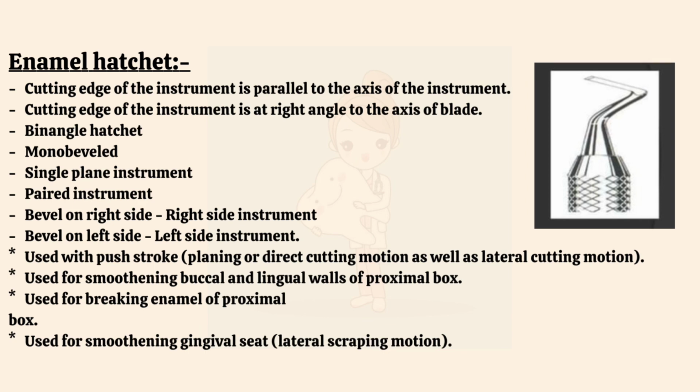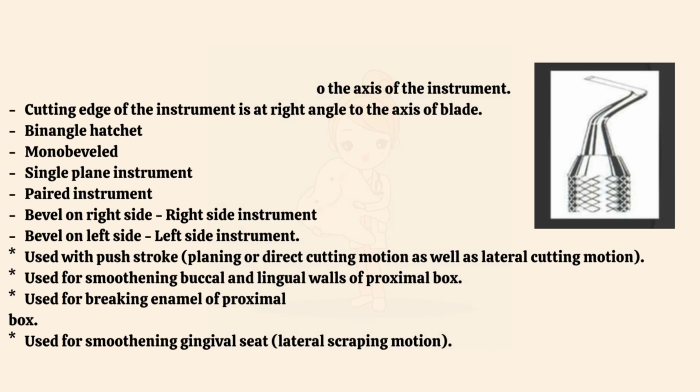Used for smoothening buccal and lingual walls of proximal box. Used for breaking enamel of proximal box. Used for smoothening gingival seat, lateral scraping motion.